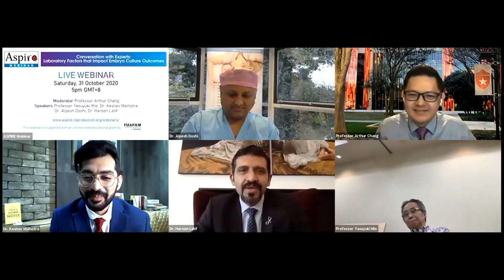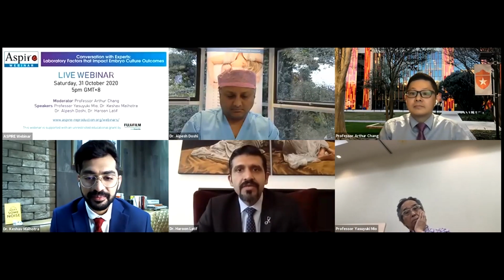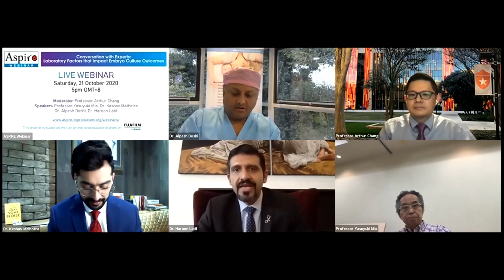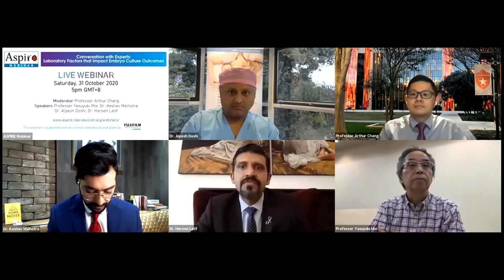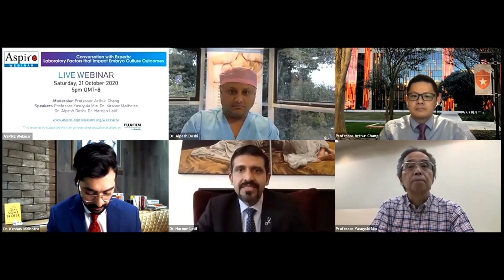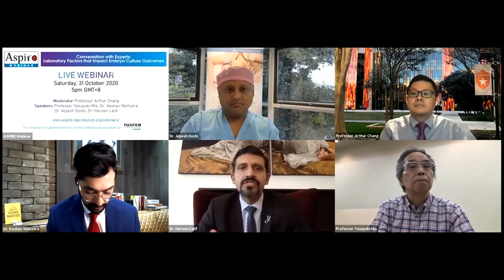The thing is, there are so many variables, as I mentioned during my talk, in ART, especially when you look at the key performance indicators. If our eye is not on the ball, then obviously there'd be slight changes in your program, and before you realize it, it'll be translating into your clinical pregnancy rates and the live birth rates. So I think a good thing to do is not to change a lot of things at the same time. If you want to make changes, just go one by one. That is the best. Obviously, there are instances where 2 or 3 variables come at the same time. However, a good practice would be to just go step by step.